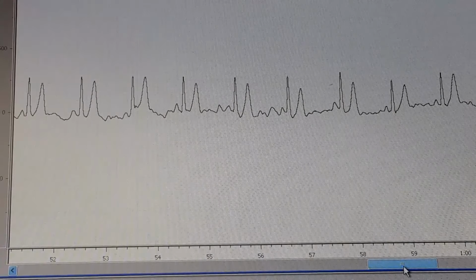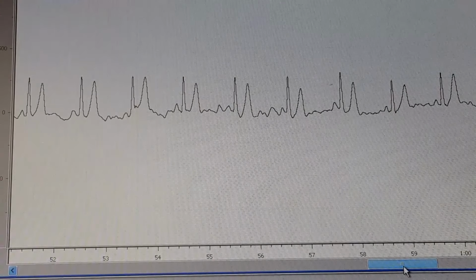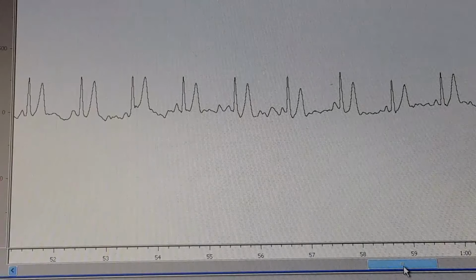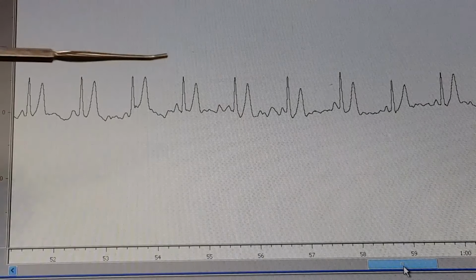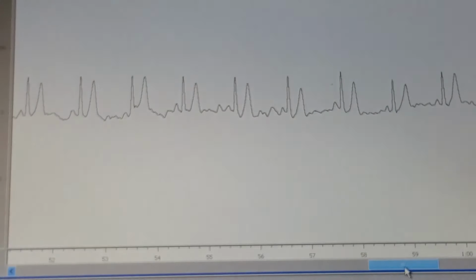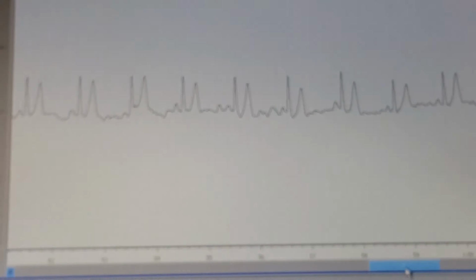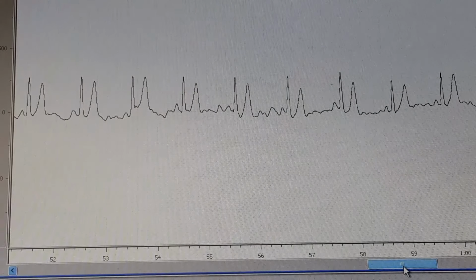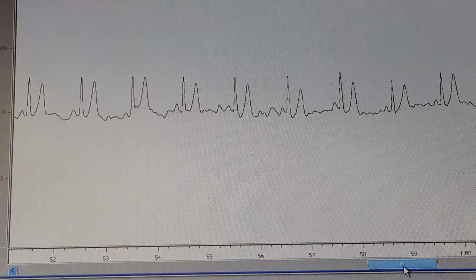So I would take whatever number I got in my 15-second window, multiply by 4, and that tells me how many beats I would have in 60 seconds, or 1 minute. In my case, my heart rate is 60 right now, today. 60 beats per minute. Count the QRSs in a 15-second window and multiply by 4. If I had a 30-second window, I would count all the QRSs in 30 seconds and multiply by 2. Easy way to calculate a heart rate using an ECG. And in the practice section, I'll give you a couple practice questions so that you can do this.